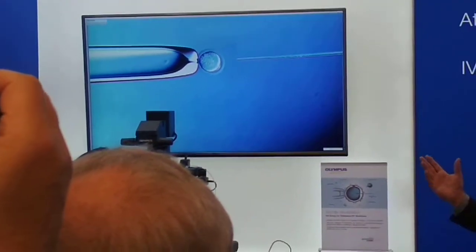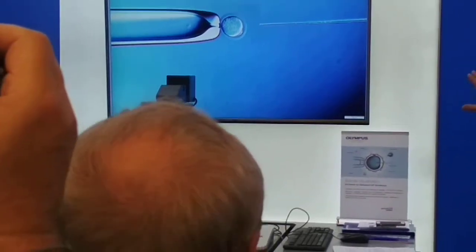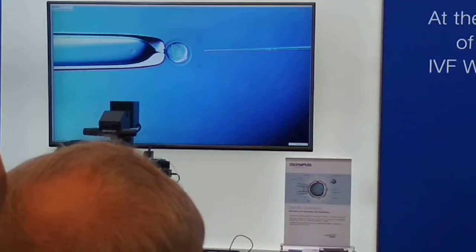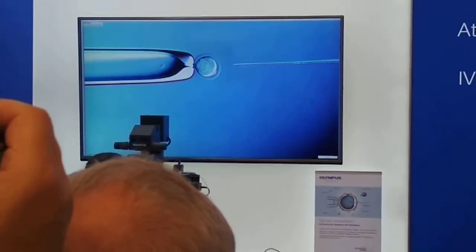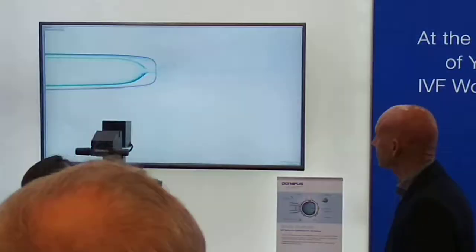Now, like we have in the sample, this is a normal Hoffman image. Maybe due to the camera you can see it a little bit bluish, but under the microscope it's the normal image that you can see. And now we can switch to polarization at 20 times.